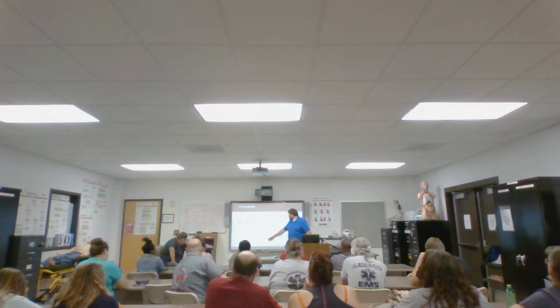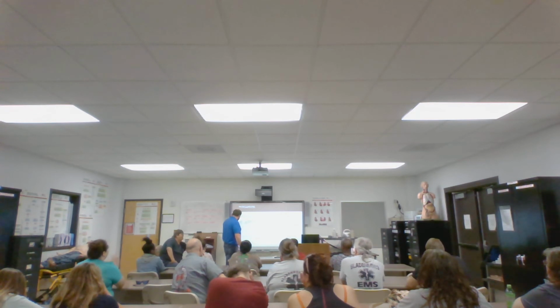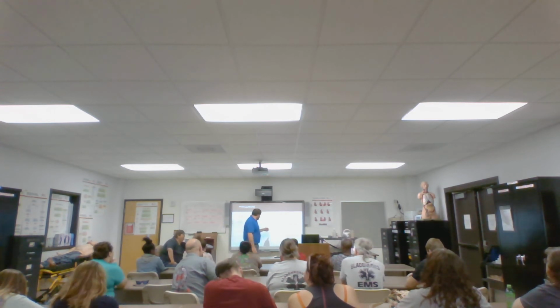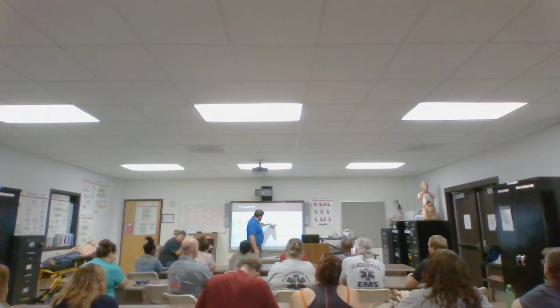You've got your normal 12 lead, everything marches out, normal QRS complexes, normal T waves. Then over here you've got this. Have you got elevation? Got elevation? Don't have it there. What do you got in AVR? What do you got there?